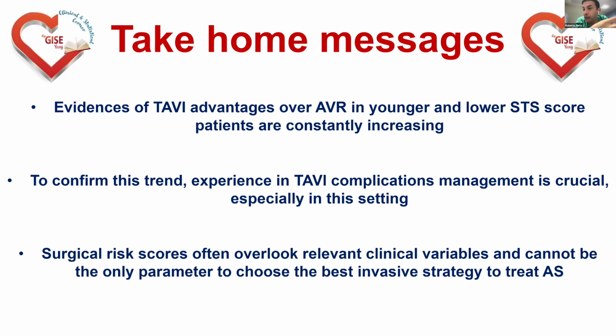So in our center, for example, and I know also in many centers across Europe, we use a small protection of the main axis by putting just a wire into the distal SFA, for example, in your case, in the right SFA, because if something happens, I mean, if there is some small flow-limiting dissection or even a bleeding, even a small perforation, you are very quick in putting a balloon and you can use your time to plan a rescue strategy.